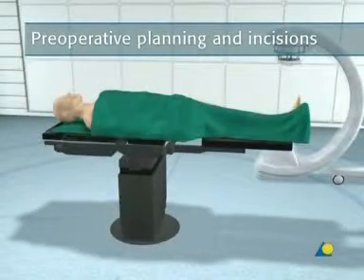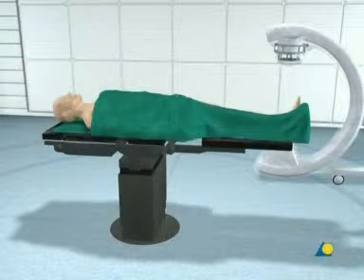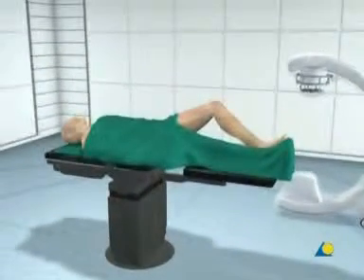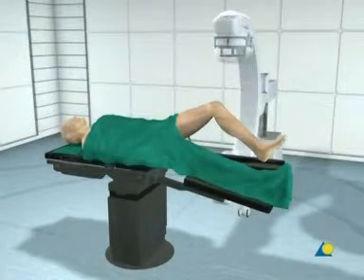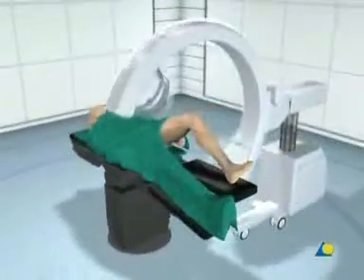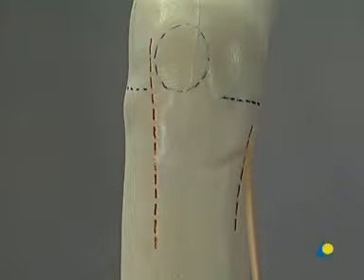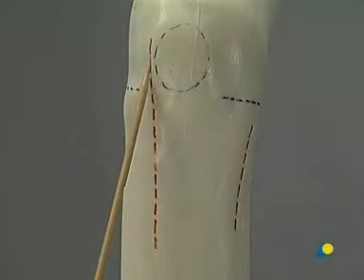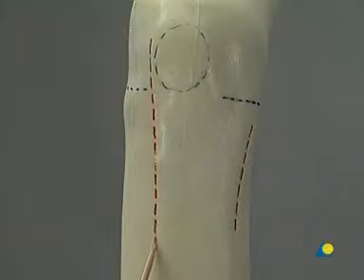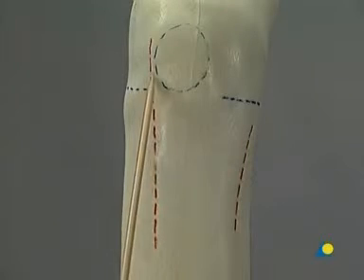Preoperative planning and incisions. The patient is positioned supine on the operating table with the injured knee flexed approximately 60 degrees. The uninjured leg is lowered so that C-arm images can be taken in both AP and lateral planes. To fix such complex injuries, two separate incisions are preferred — one posteriorly medially and one laterally — in order not to interfere with the delicate soft tissue cover over the tibial tuberosity. The patella and the lateral and medial joint lines serve as landmarks.